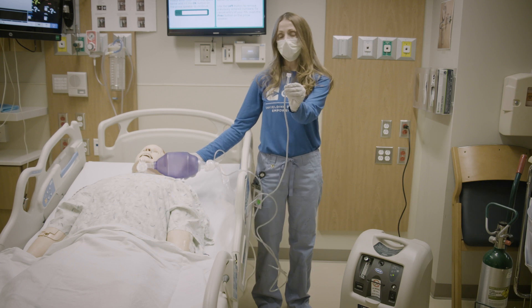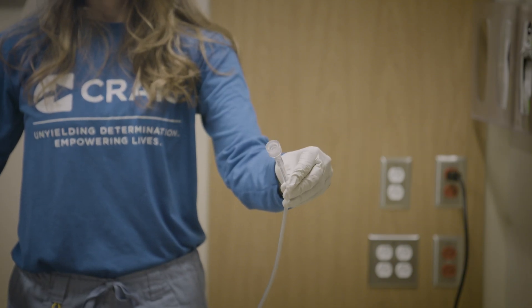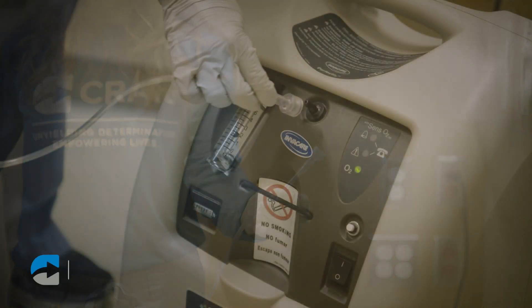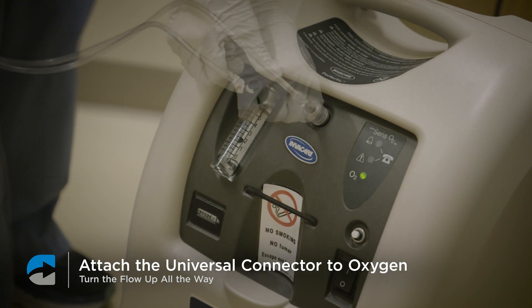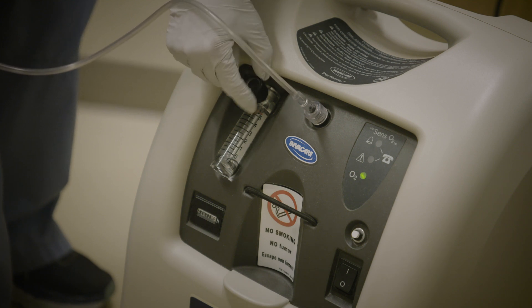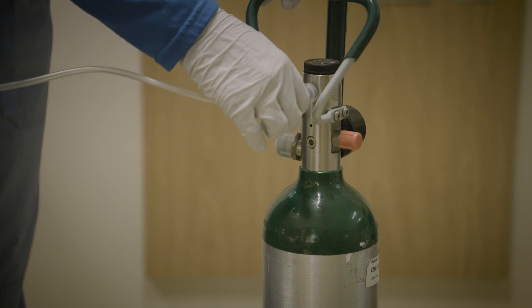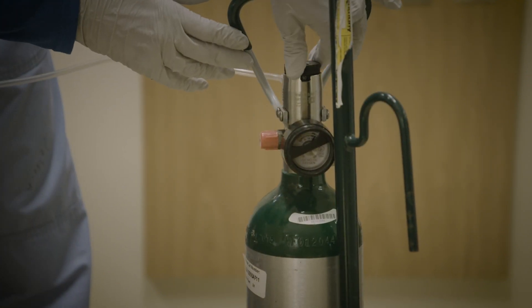The manual resuscitator has a long tube with a universal connector on the end. The connector will fit onto any oxygen compressor or tank. Secure the end of the tube to the connection point on the compressor. If you have an oxygen tank, the tube connects to the tank in the same way. Connect the tube, then turn the flow all the way up.